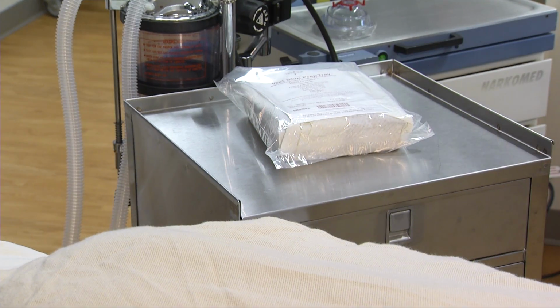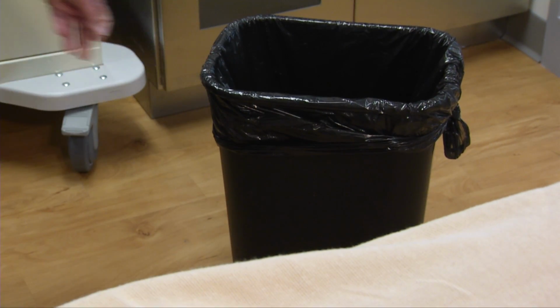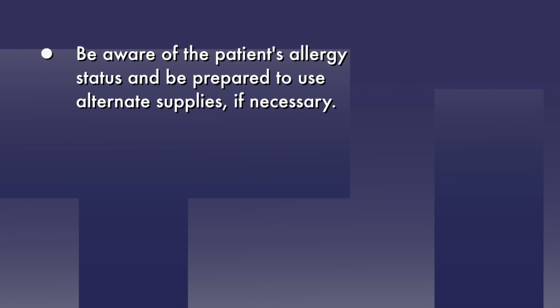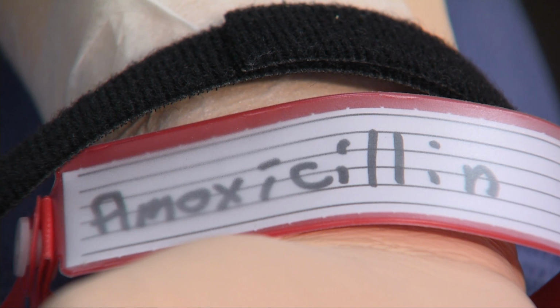In addition to the prep set and the prep stand, it may also be helpful to position a trash receptacle in a convenient location for use throughout the procedure. Be aware of the patient's allergy status and be prepared to use alternate supplies if necessary. In this situation, the patient is allergic to amoxicillin and it will not be necessary to use alternative materials.